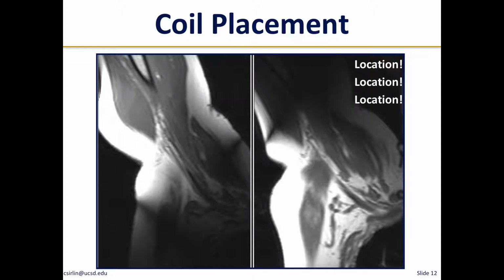So once upon a time in body imaging, we used to do brachial plexus MRI, and here we were trying to look at the nerves coming through the axilla. And initially we placed the coil. By the way, the coil is basically like an antenna, so it's what's listening to the signal. We put the coil up here by the upper arm when we were interested in the axilla, and then all we did was reposition the coil, and then we saw the area of interest.